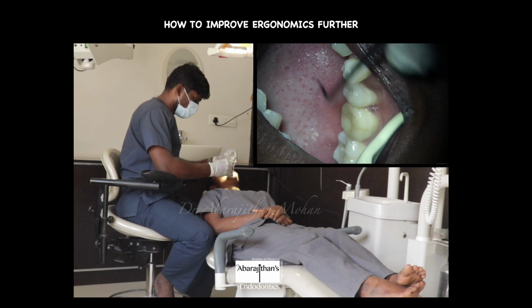So for people who have already mastered the basics of ergonomics, how can we improve further, or how can we achieve the highest level of work precision, work standards, and also ergonomics? The problem is, with the basic ergonomics, in spite of following all the principles without using magnification, we still do not achieve the highest level of ergonomics, because you still tend to bend forward. You can see here both the back and the neck have to bend for me to achieve proper vision.